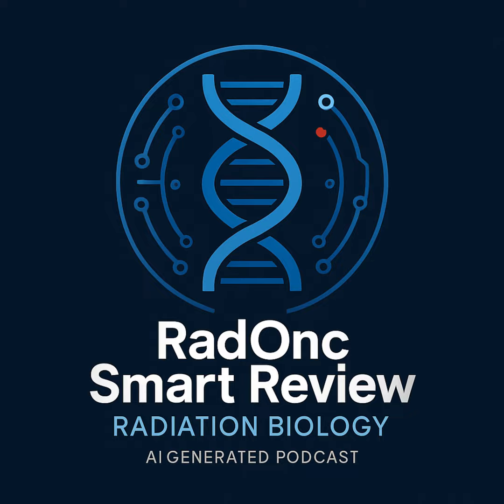All right, let's wrap up this session with a quick summary of the key points. Okay. We started with CT anatomical imaging based on differential X-ray attenuation. Remember, Hounsfield units quantify density, and contrast agents like iodine, barium, and gadolinium enhance visibility. Then we dove into PET scan, functional imaging using positron emitters. Key physics: positron emission, annihilation, two 511 keV photons at 180 degrees, coincidence detection.